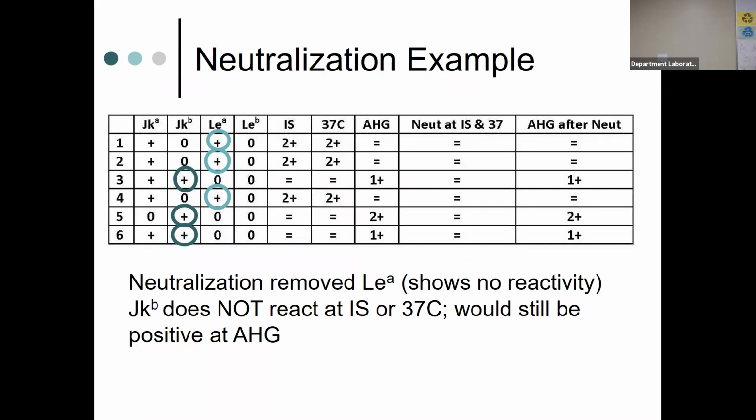Oh yeah, sorry, I was looking at the wrong column. Yeah, both are being expressed here, right? Heterozygous, weaker antigenic expression gives us a weaker reaction in patient plasma, right? Versus panel cell 5 is homozygous positive, okay? That's definitely dosage being demonstrated there. But notice, your reactions were like that before neutralization treatment, and then they also remain that way after neutralization, right? So it's actually present in both testing, okay? Sarah, does that help? Does that answer your question? Yeah.